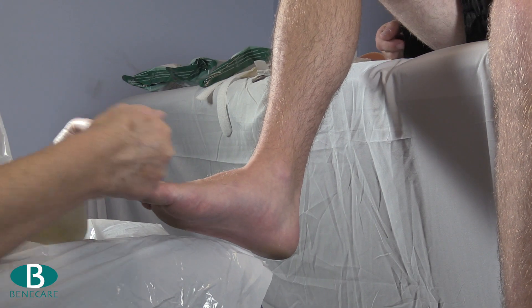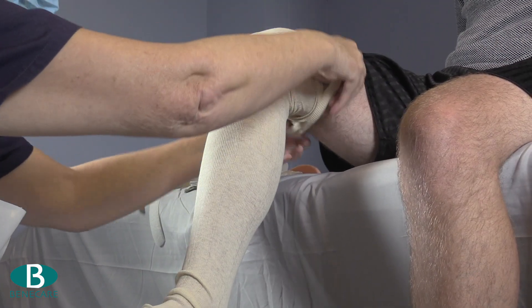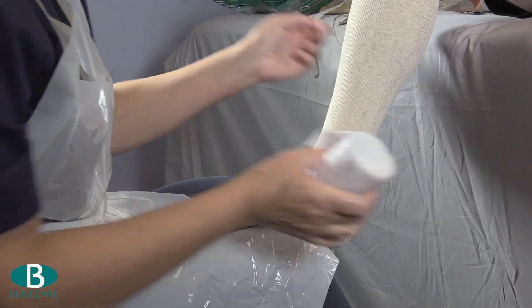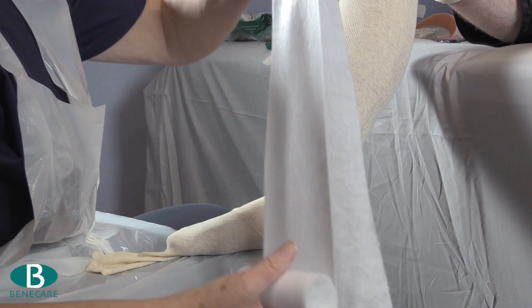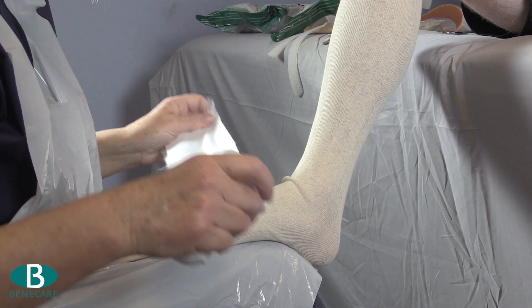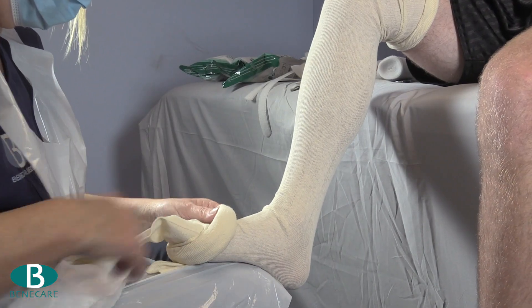Apply the first layer of stockinette from the toes to above the knee, then continue by applying a protective strip down the posterior aspect of the leg. A double layer of undercast padding is used because this provides adequate protection and has good conformability to the leg; however, adhesive felt or fleecy web is also a great alternative.